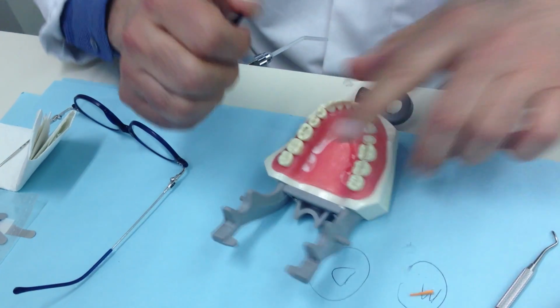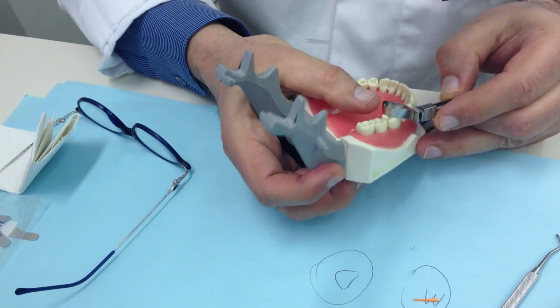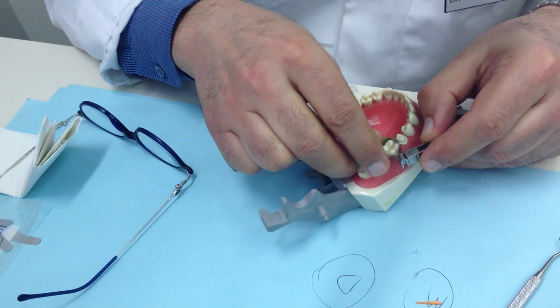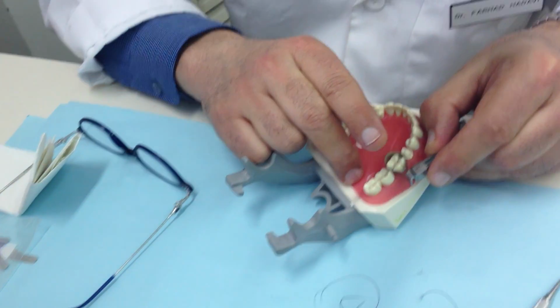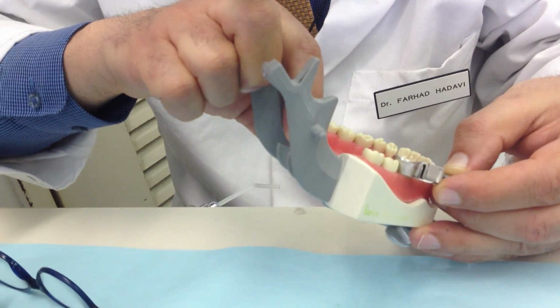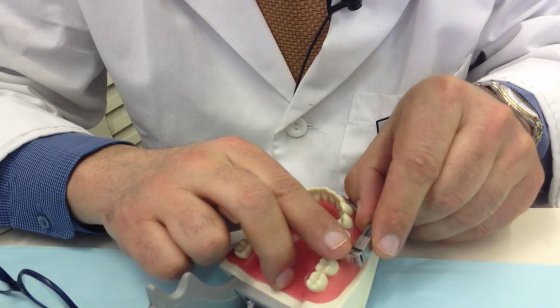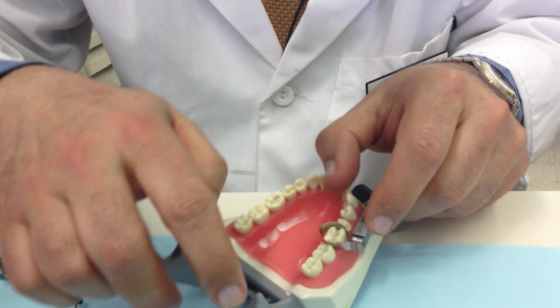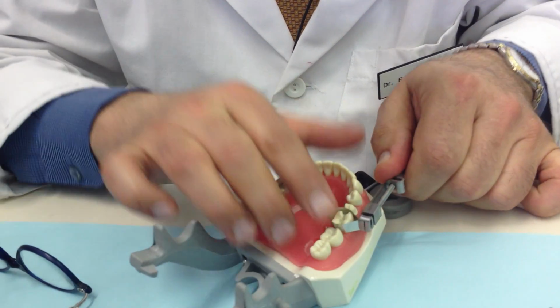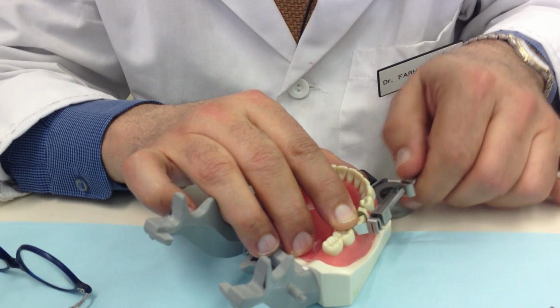Okay, now I place my retainer around the tooth, and now I look at it. It is about 1.5 millimeter above the adjacent tooth marginal ridge. Can you see that one? And I place my finger over here. Let me do it correctly. I place it over here and tighten this one. I want the head of this one to be right in the center of the tooth structure.